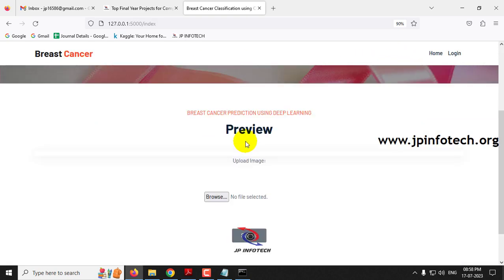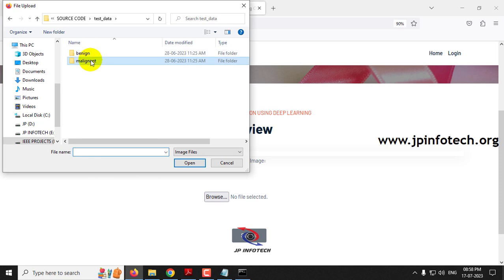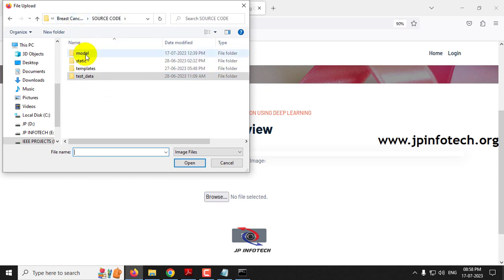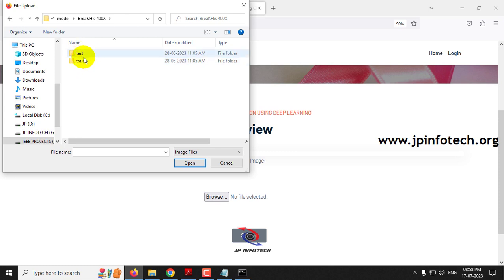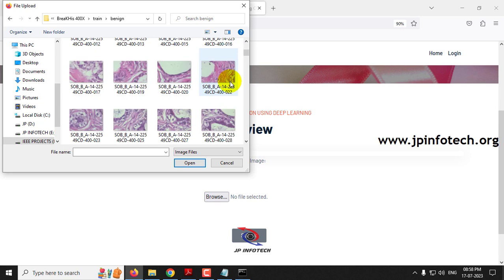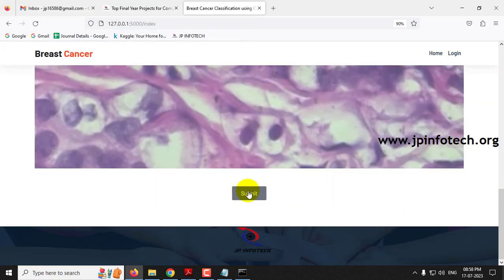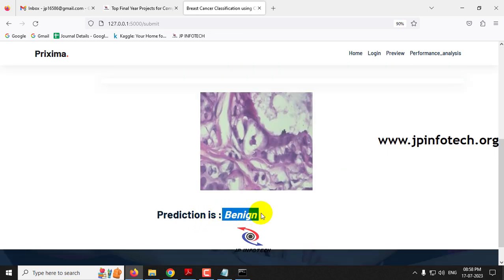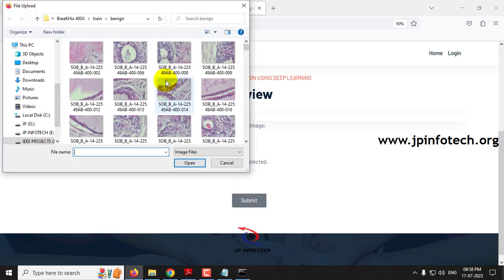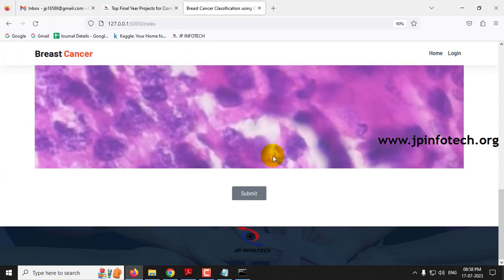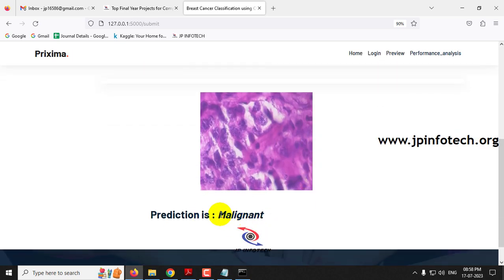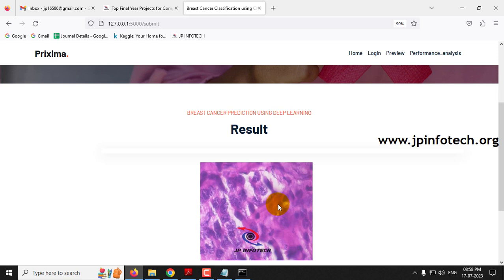You can also check with the other images given in the benign and malignant test folders, as well as from the training dataset. Go to the model folder, open BreaKHis 400X, open the train folder, and select a random image. Click submit — the predicted result is 'benign.' Repeat the process selecting a malignant image from the train folder and click submit — the predicted result is 'malignant.' All tested cases are showing results exactly and perfectly. You can check with other images in the test and train folders as well.